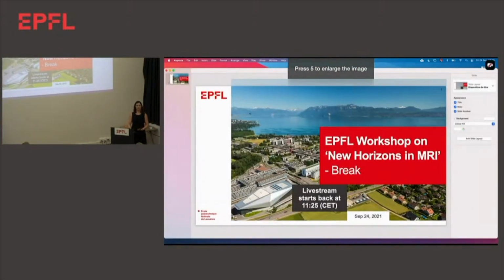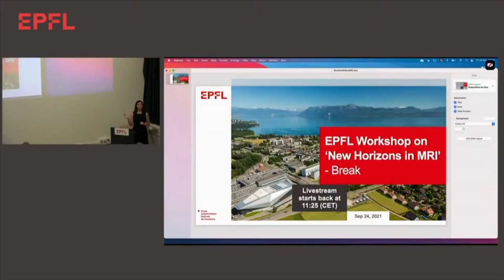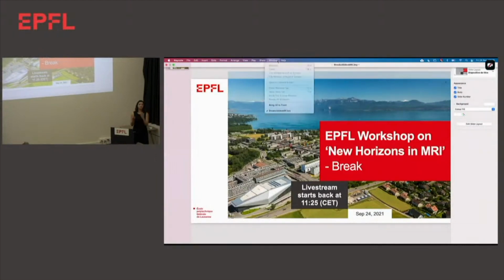Once we get to those really high T2 values that we don't expect to see, in the heart especially, or just in the body, then we know that those signal evolutions are going to start to look similar, because we're just not able to capture the differences.